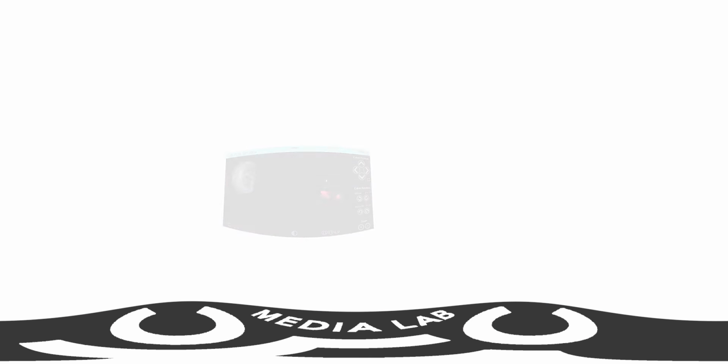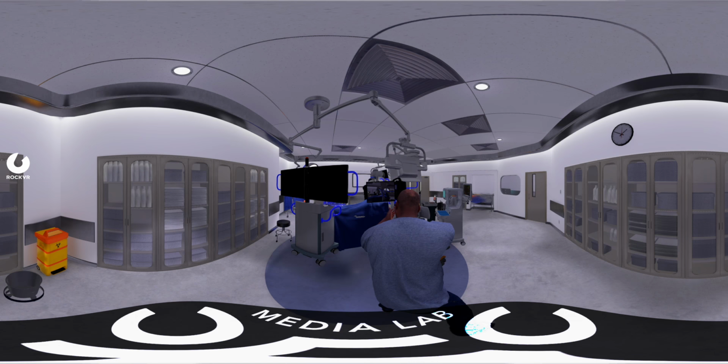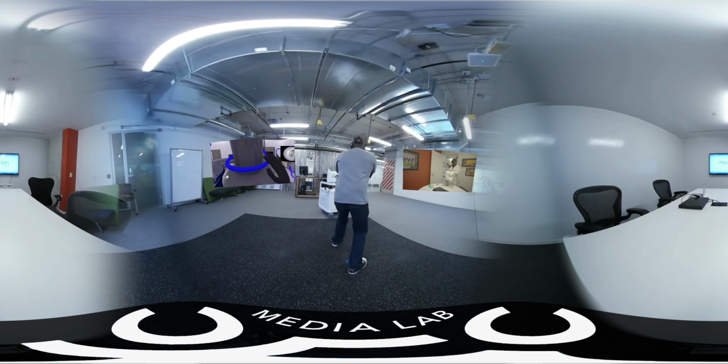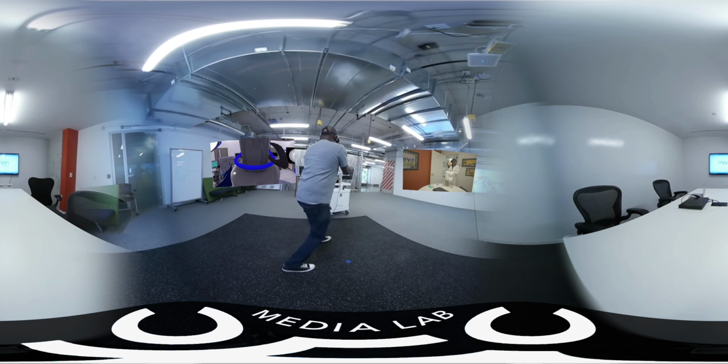As you can see, I'm going to target that bottom part of the kidney. So I'm going to move it over, and then tilt it down just a little bit like that. Then you can just watch what happens as I activate the machine. You can see in my left hand my needle moving, and I want to line it right up. That's why I call it a bullseye technique. I have no idea how deep it's going, but if I line it up in this place, I'll show you how we find our depth.